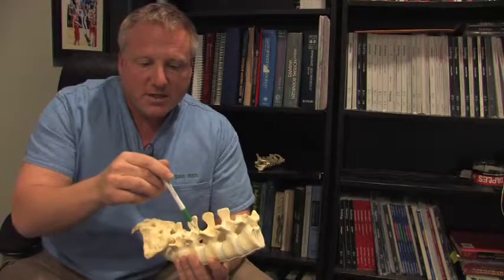In summation, transforaminal epidural steroid injections, we will do the injection at the level of the foramen or hole where the nerve root comes off, typically directed at a patient with symptoms down the legs or what we call radicular symptoms. We place the needle directly near the nerve root and do our injection. Allow the cortisone primarily that's in the injection to de-inflame the nerve root and hopefully de-inflame the other tissues that are compressing on the nerve root.